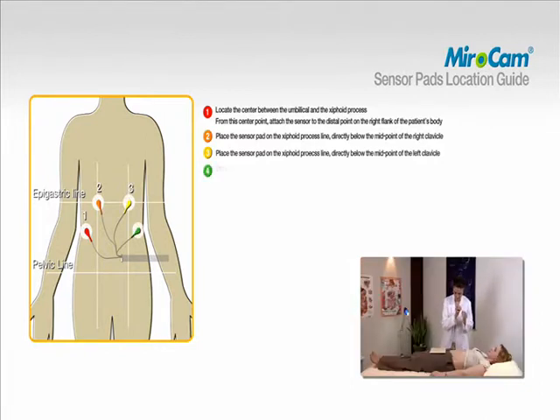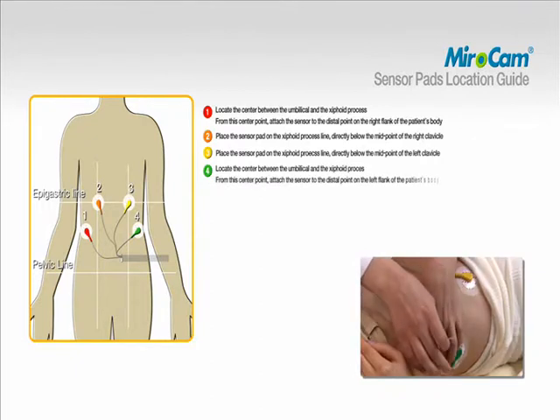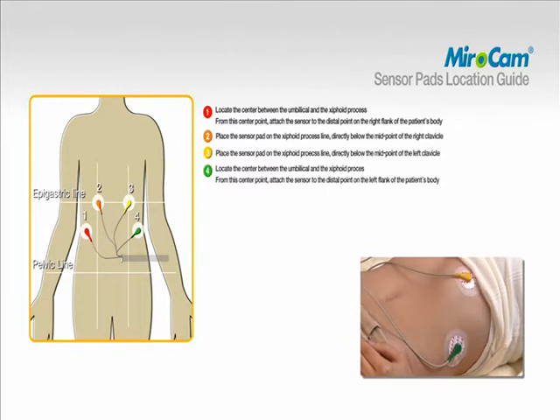To attach pad number four, locate the center between the umbilical and the xiphoid process. From this center point, attach the sensor to the distal point on the left flank of the patient's body.